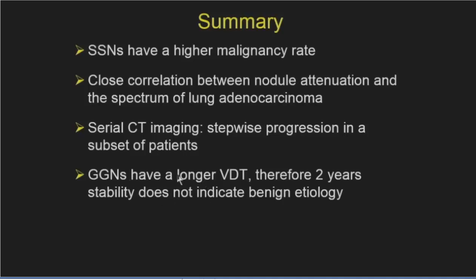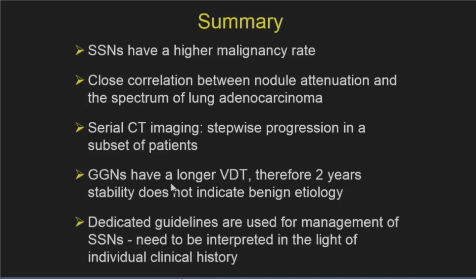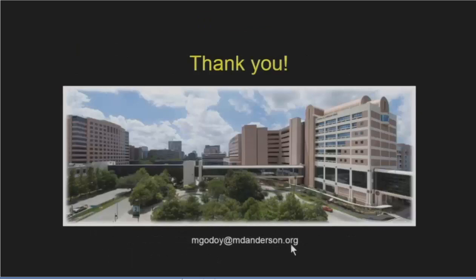And because of their longer volume doubling time, 2-year stability does not indicate benign etiology. We have to follow them longer, at least 3 to 5 years. And there are dedicated guidelines for management of both incidentally detected and screen-detected subsolid nodules. But again, we have to look at each case on a case-by-case basis. So thank you so much for your attention.